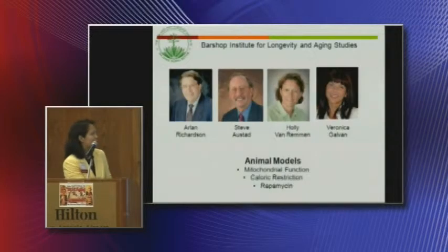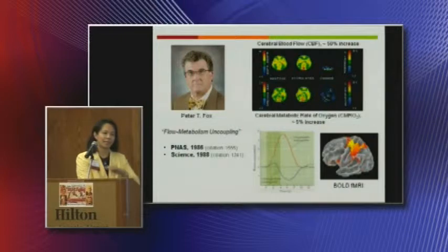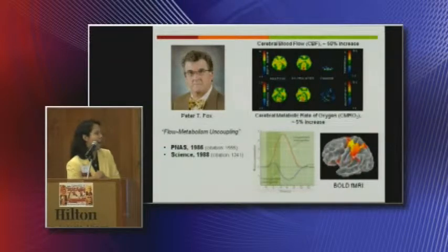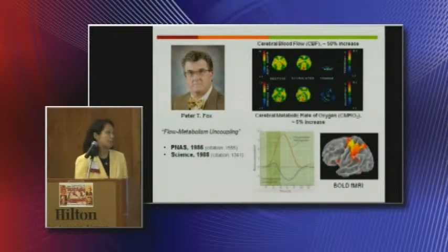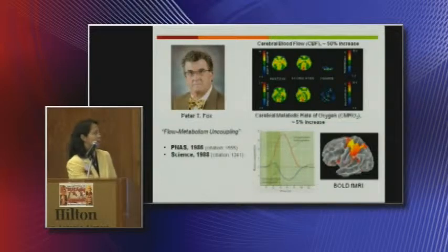And this is the MRI imaging we're using every day. How can we get this? The oxyhemoglobin, when you get into the MRI, doesn't disturb the MRI field, while the deoxyhemoglobin will distort the magnetic field and decrease the signal. So if blood flow increases dramatically compared to oxygen metabolism, you can see that the oxyhemoglobin concentration is way higher, so oxygenation can show in the MRI. This is the fundamental of the formation of MRI imaging. With this background, in the following talk I'll keep coming back to PET imaging and fMRI.